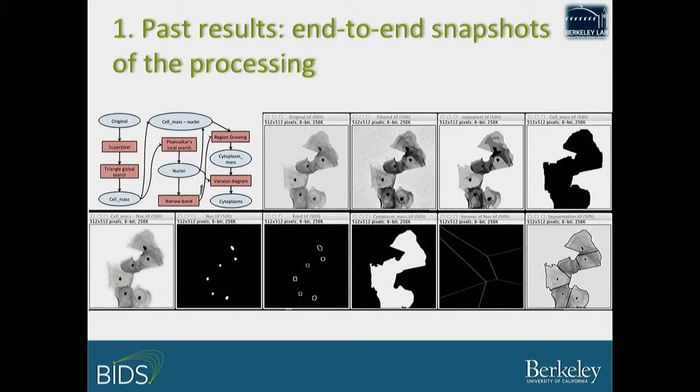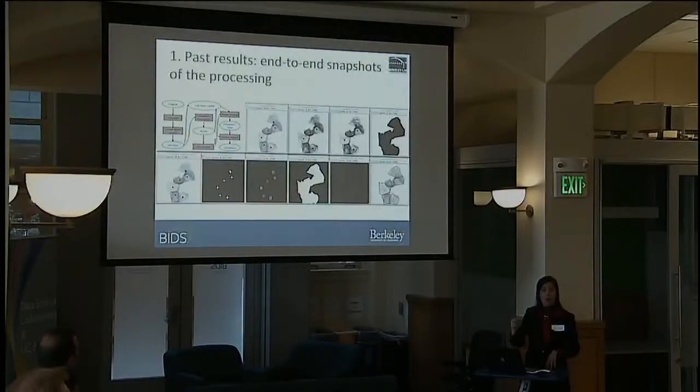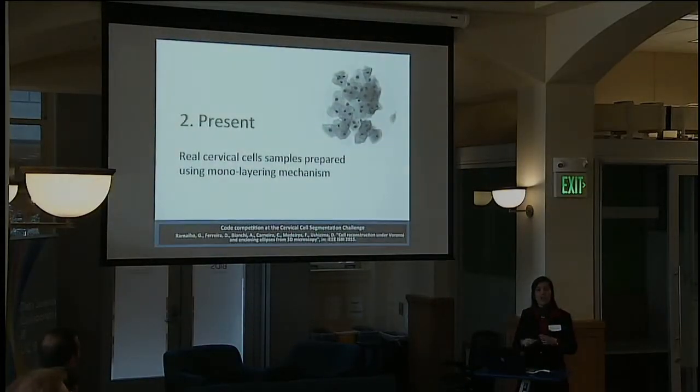And here is an end-to-end workflow of what we are doing. Starting from the top left, you have the raw data set, the raw image. There are several transformations that this picture or matrix goes through up to the time that we can identify where each one of them is. Why is it difficult at all? Because these cells overlap, so it's quite complicated.